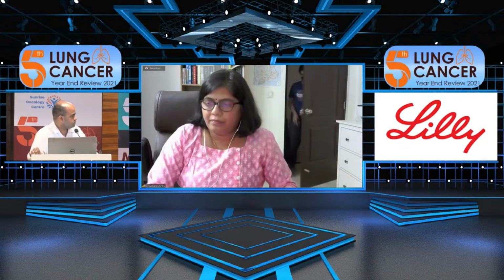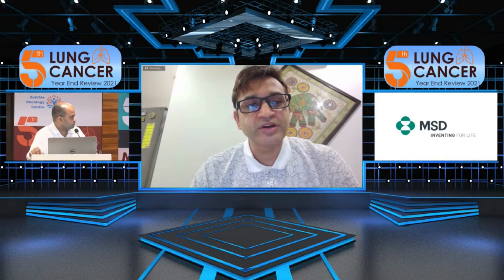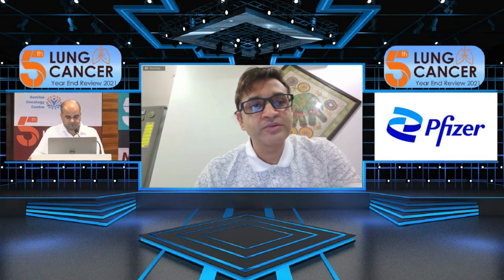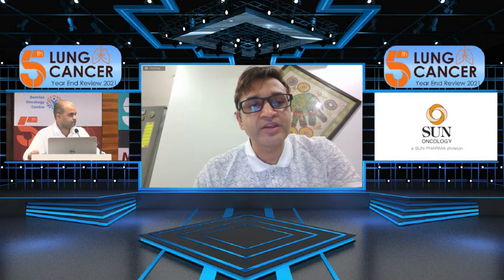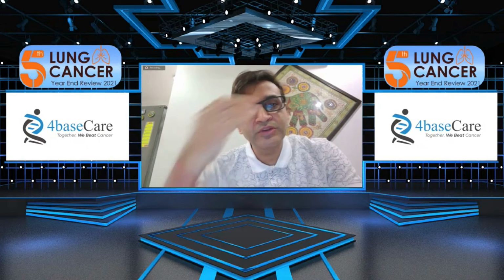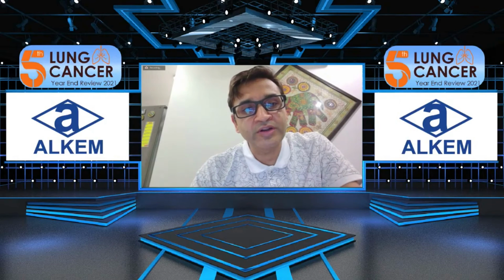Yeah, so that is the very common problem which we especially face in India because the archival of these blocks are not done as per the standard recommendations. So, if we have to preserve, do the good molecular workup on the old block, the material should be archived in a proper ambient condition. So the air conditioning of the room as well as the temperature. So that is very important, especially even in Mumbai we face a problem because the environment is quite hot as well as humid.